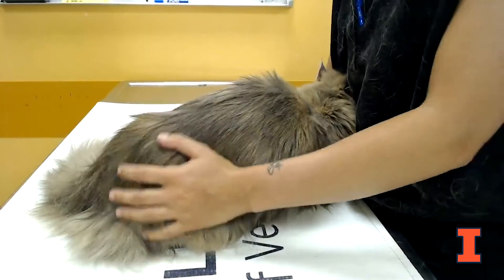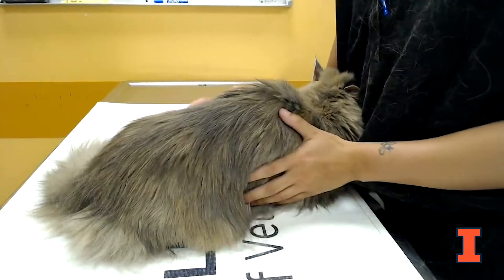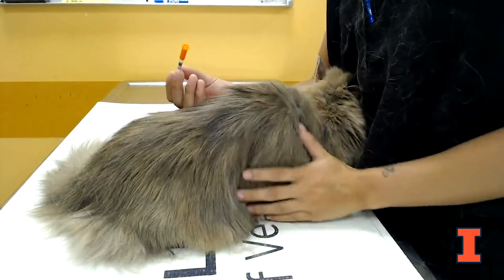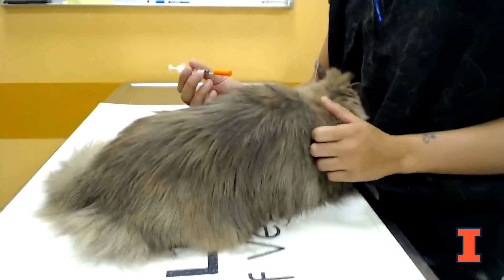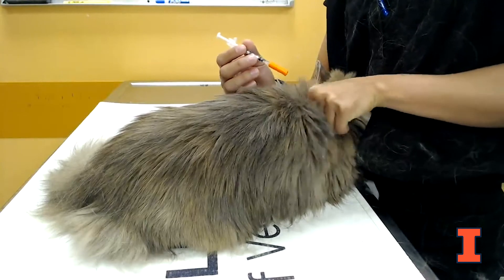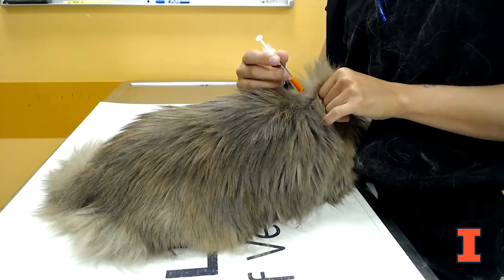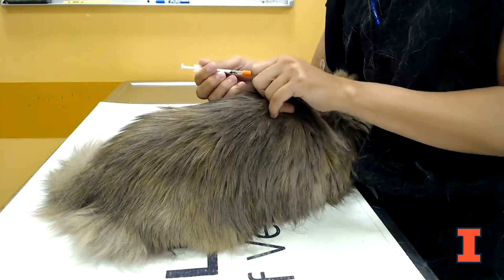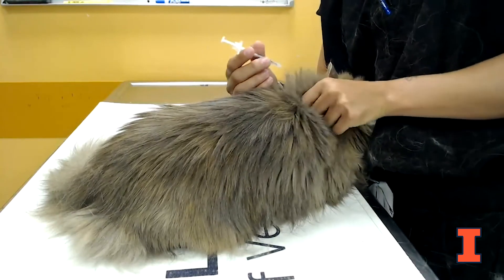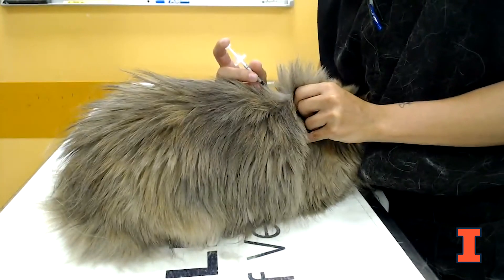Now we're going to show you how to actually give the insulin to your pet. Sometimes they will be a little wiggly, so if you need to change position, feel free to pause and adjust. The main thing to think about is that this medication is supposed to be dispensed under the skin. You're going to tent the skin up into a little triangle to put the needle just under the skin. I'm going to tent her skin up near her shoulder blades — you don't want to hit the same spot every time, but this tends to be the best place to administer.